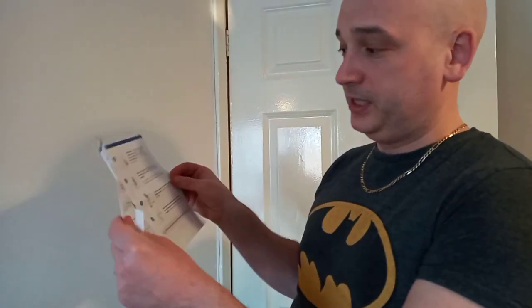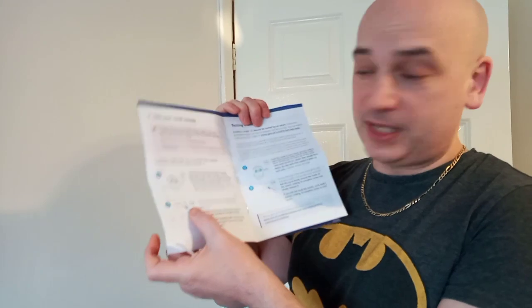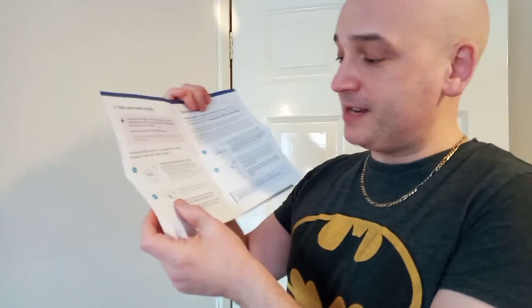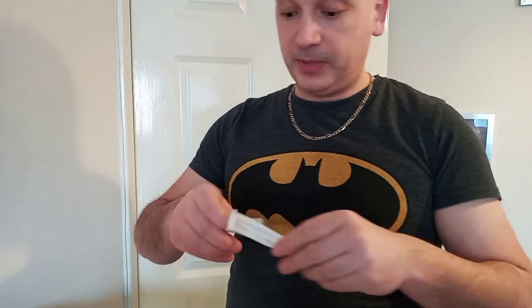According to the instructions, you have to put the swab onto your tonsils at the back and swipe it around, then stick it two and a half centimeters up your nose and swipe it around ten times. Got to be careful not to touch things. It also says you need to make sure you've blown your nose and have no mucus, so I've done that already. We have a mirror ready — tonsils first.